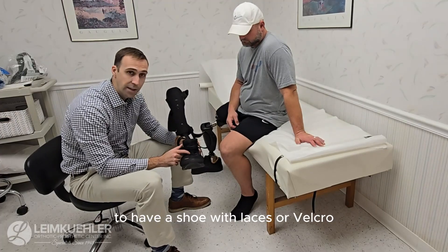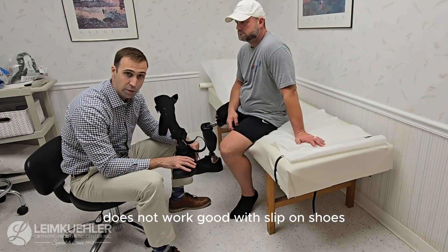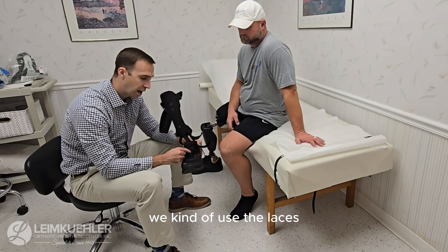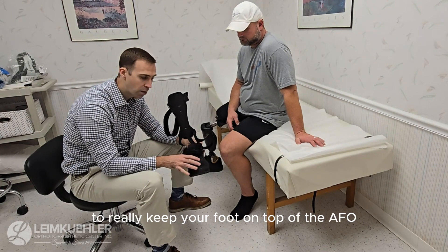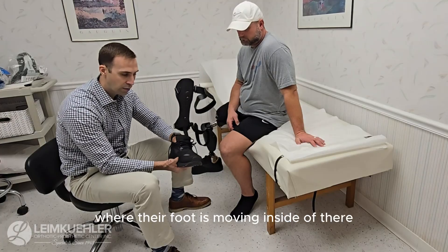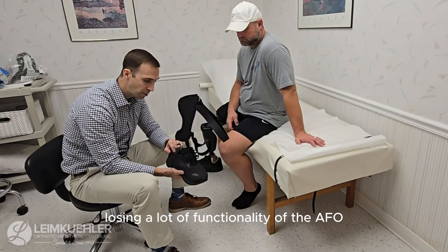It's best to have a shoe with laces or velcro; it does not work well with slip-on shoes. The reason for that is we can't tighten this down over your foot, so we kind of use the laces and the velcro as a second strap to really keep your foot on top of the AFO. Otherwise, a lot of times with just a slip-on, patients get their foot moving inside of there and they lose a lot of functionality of the AFO.